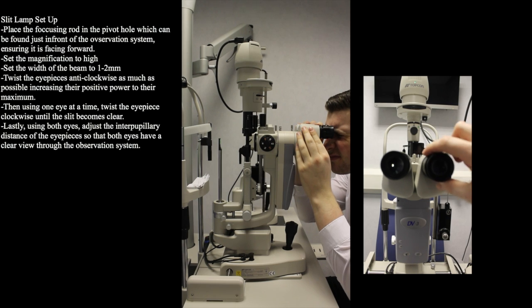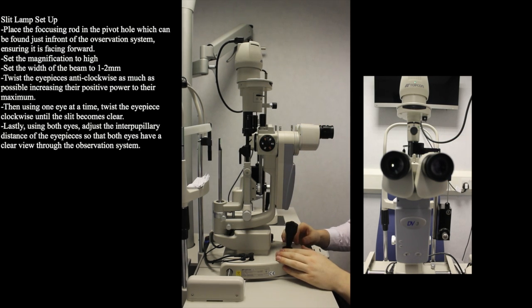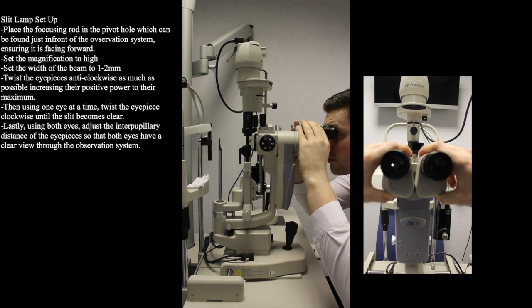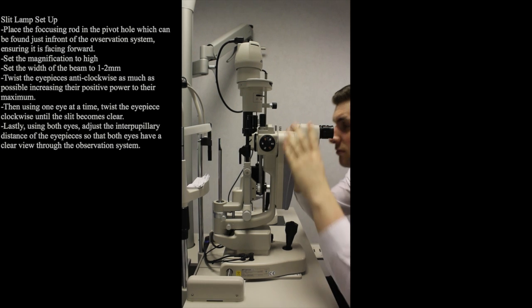If you overturn the eyepiece the image won't become blurred but it will force us to accommodate which may lead to fatigue and inaccuracy. Lastly using both eyes adjust the interpupillary distance of the eyepieces so that both eyes have a clear view through the observation system.